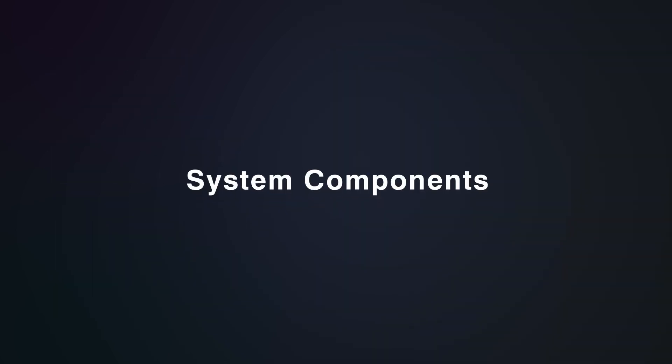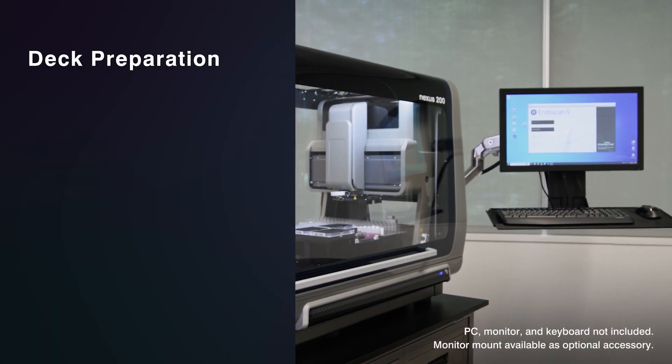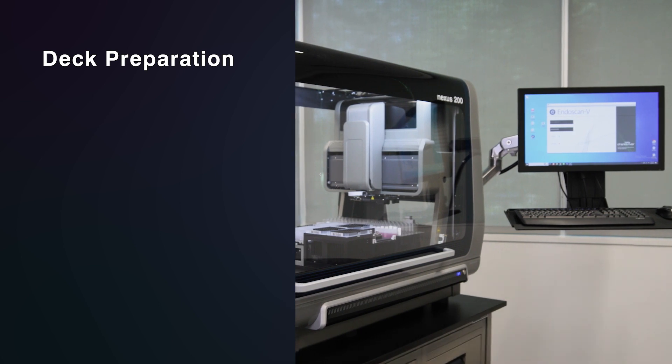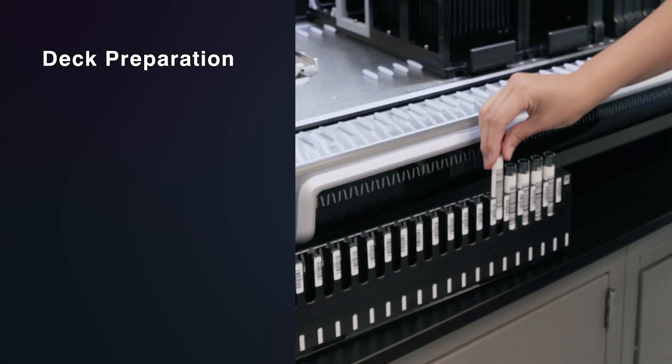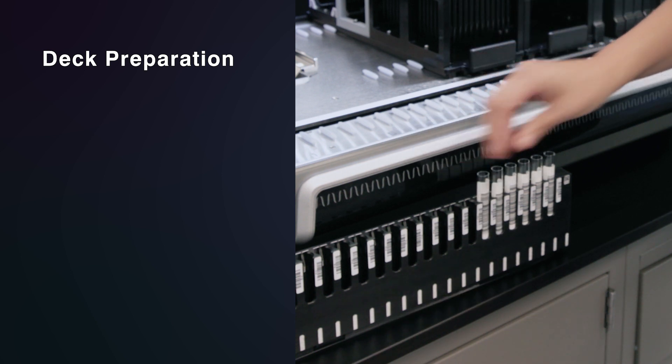The Nexus 200 allows for simple preparation and setup in a few steps. To begin, power on the Nexus 200, log in to the EndoScan-V software. The door can be opened and samples can now be prepared and loaded into the racks.